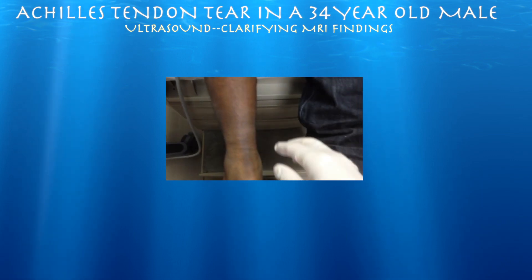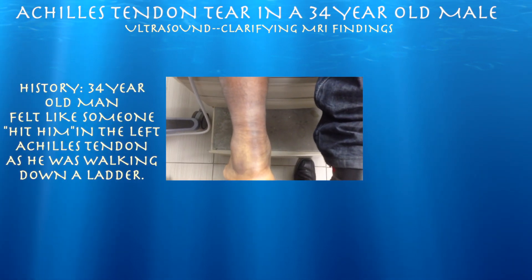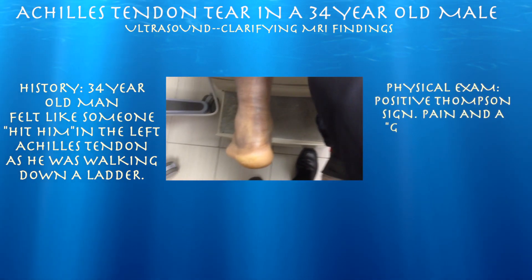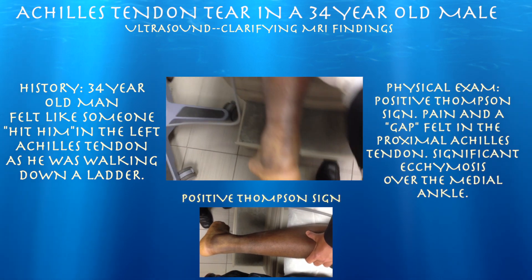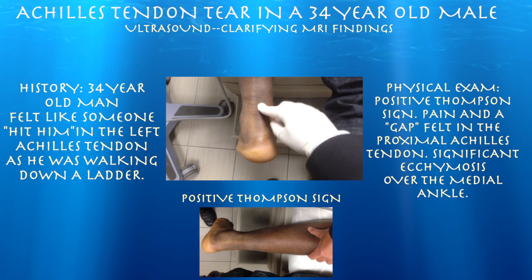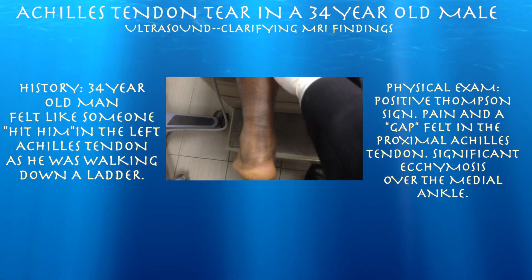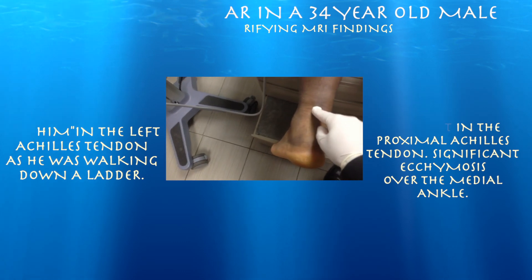This 34-year-old male was walking down a ladder about a week ago. As he was walking down, he felt like someone hit him in the back of his Achilles tendon — classic for Achilles tendon rupture. He has a positive Thompson test, and my finger does fall into a gap kind of near the musculotendinous junction, which is where he's tender.